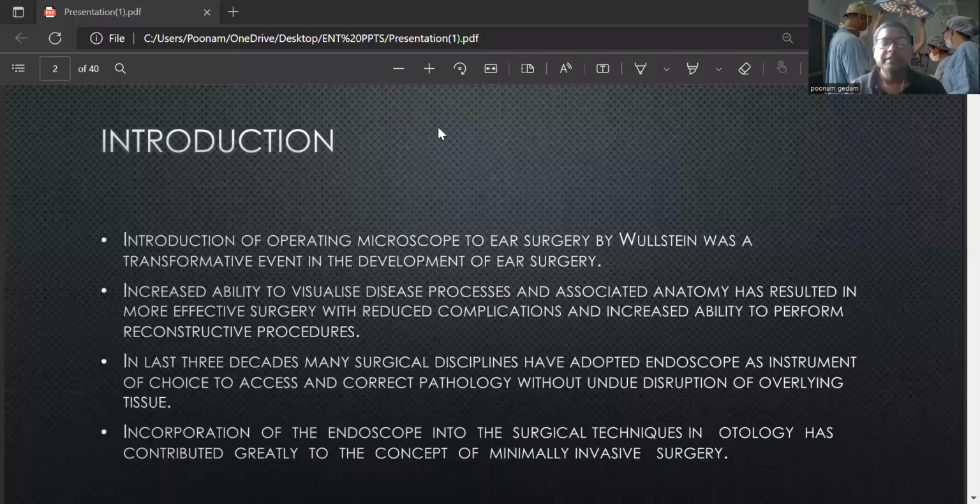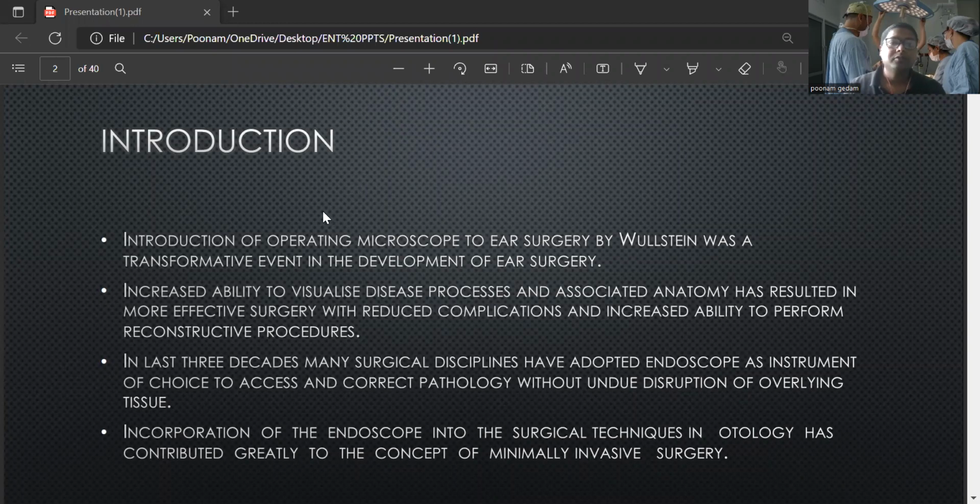So in this video, we'll discuss endoscopic ear surgery. This is a very hot topic in exams also. It comes frequently in MS and DNB exams. They give a 10-marker on comparing the endoscopic and microscopic technique for ear surgery. So we'll discuss it, coming to the introduction of endoscopic ear surgery.